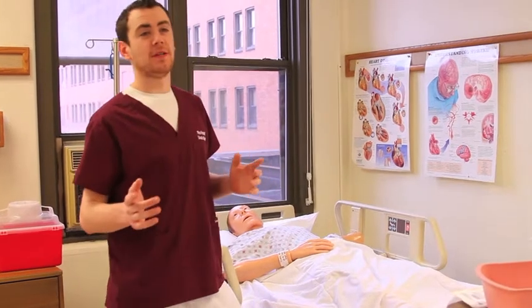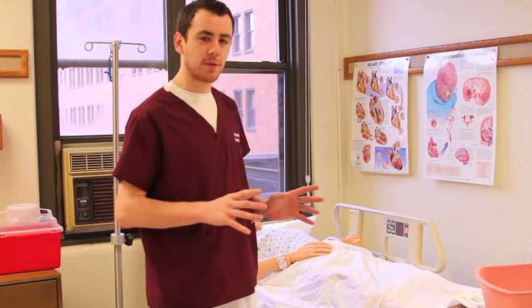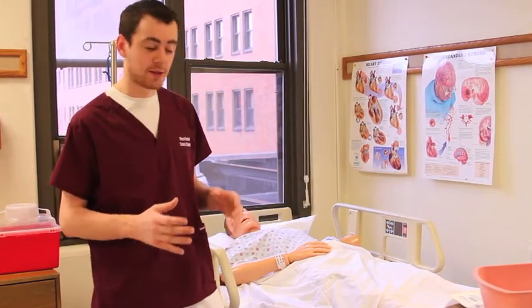Alright guys, today we're going to be talking about a couple different types of dressing changes, including clean and sterile, and the differences between each one. So we're going to start with the clean dressing change and show you guys how to do that. So why don't we get started?